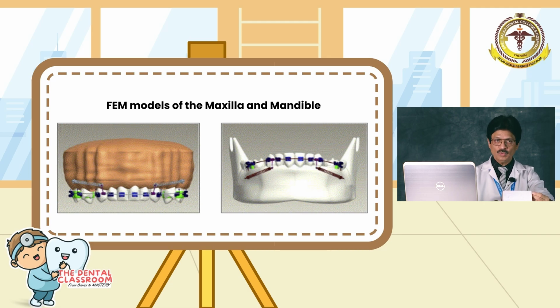So as we all know, the type D3 in the posterior maxilla means one with a thin layer of about 1 millimeter of cortical bone surrounding a core of dense trabecular bone, and the type D2 was in the posterior mandible with a thick layer of about 2 millimeters of compact bone surrounding a core of dense trabecular bone. And of course, all the other specifications we did take into account, namely the 3D quadrangular and the hexagonal elements for the tooth and the standard edgewise bracket models.